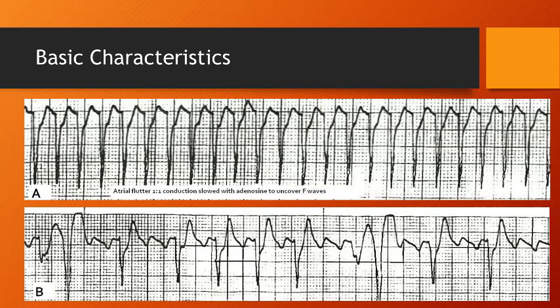Now coming towards the heart rate. Heart rate is not of so much use in determining whether the tachycardia is a ventricular tachycardia or a supraventricular tachycardia. It has a very limited use in distinguishing it. When the rate is approximately 150 beats per minute, we can consider atrial flutter with, let's say, a 2 to 1 block and aberrant conduction. Although this diagnosis should not be accepted without any supporting evidence.